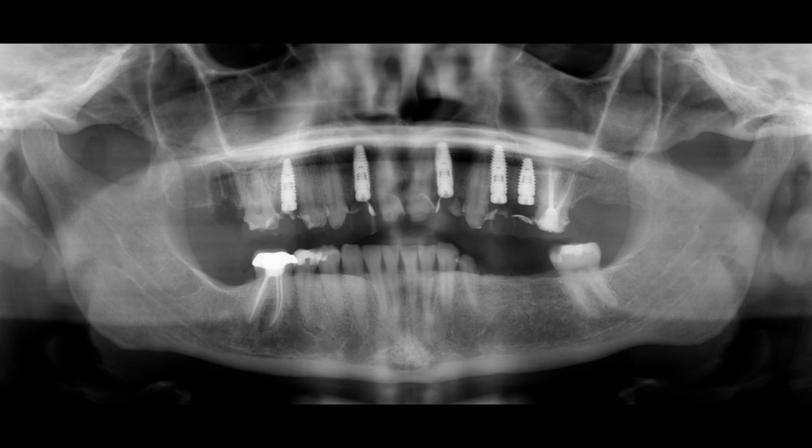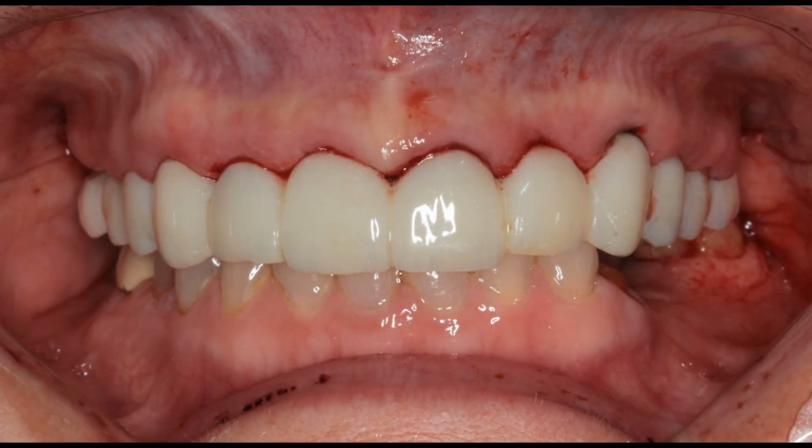Because I hope to place an implant in the molar site in the future, she's going to wear her temporary that you'll see here in just a minute. She'll wear that for 6 months rather than the standard 3 months. Here is her temporary that we made her on her first surgery. This is all on teeth, not engaging any of the implants. And again, she'll wear this for 6 months while the back molar sites heal, so that I can hopefully place an implant in those sites in 6 months.